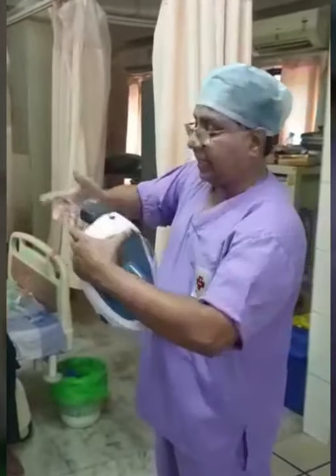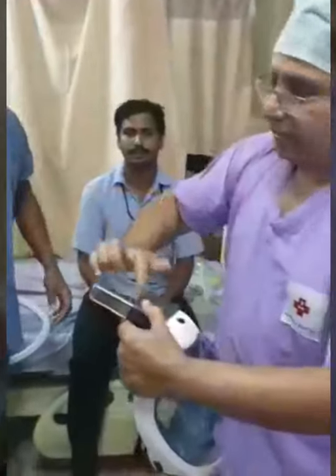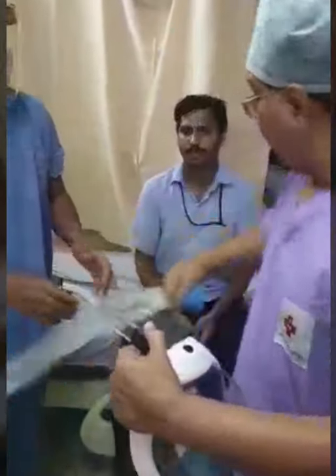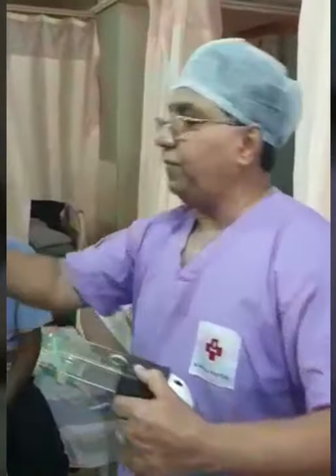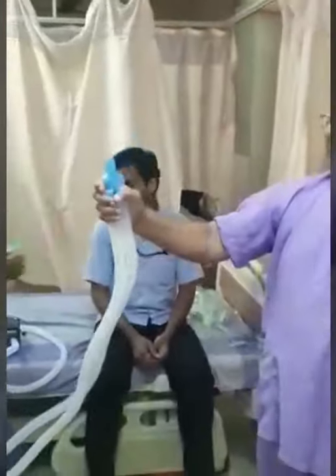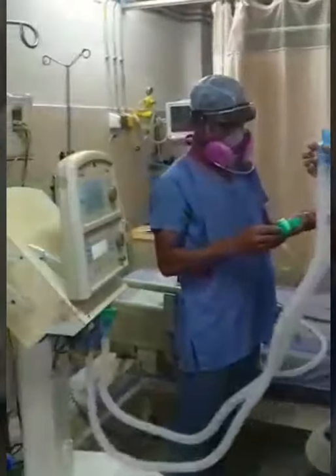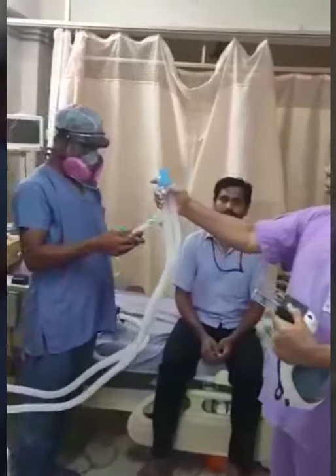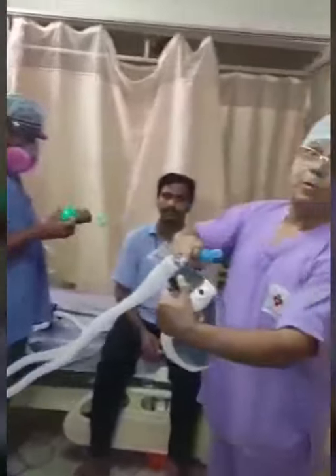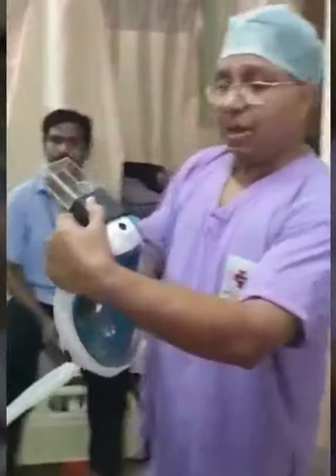The connector gets attached firmly. All that we have to do is connect the single port to a filter and a catheter mount. This is the ventilator outlet — this is a double hose ventilator that I am using here. With this double hose ventilator, we have to use a single port connector to use this snorkeling mask as a mask for NIV.